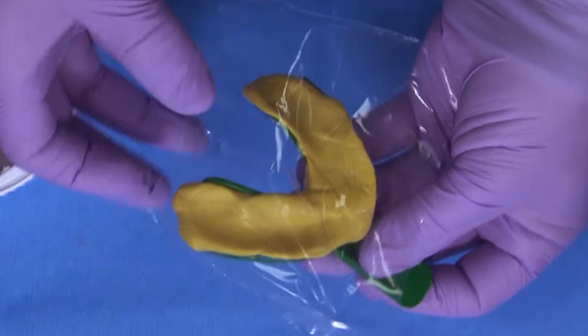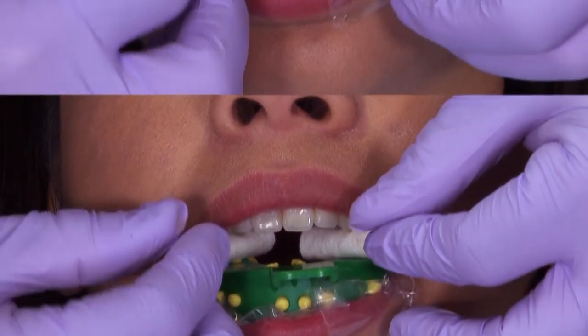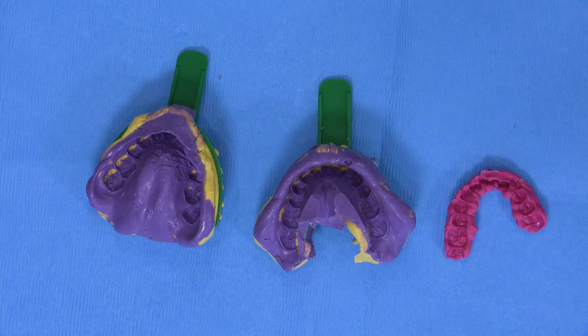Let's talk about making great full mouth pretreatment impressions today. If taking a digital scan is simply not an option in your practice, taking a perfect VPS impression is just as important. I'd like to show step-by-step the way we recommend full mouth pretreatment impressions for full arch removable appliances, as well as diagnostic model work to be taken.